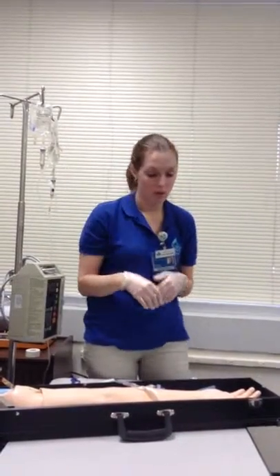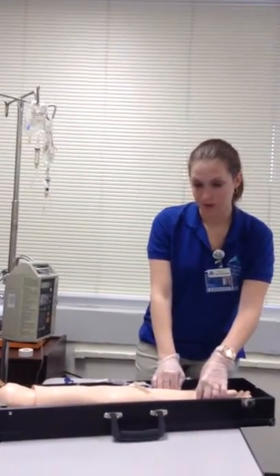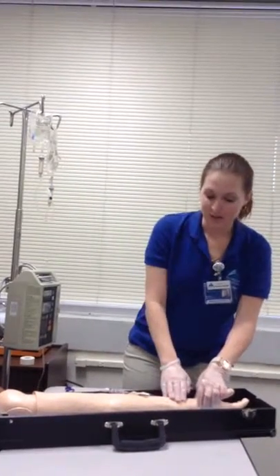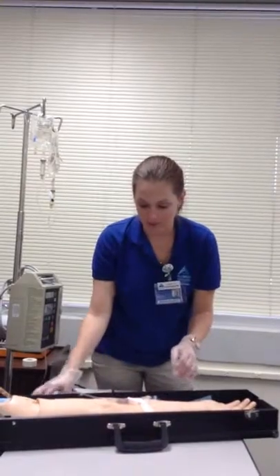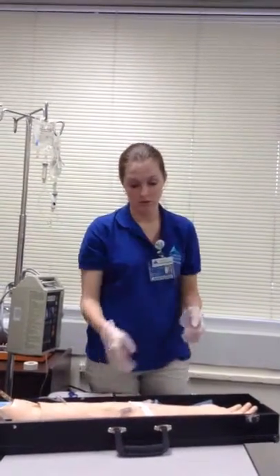Okay, and once again, if for some reason she had never had this medication, I would sit here for 10 to 15 minutes to assess and make sure that she didn't have any kind of signs or symptoms. Miss Jones, I've got to look at your armband again. Can you tell me your first and last name, and your date of birth again? Clara Jones, January 20th, 1942. All right, everything matches. I would then assess the IV site. Everything looks good. There's no inflammation or edema, no infiltration.